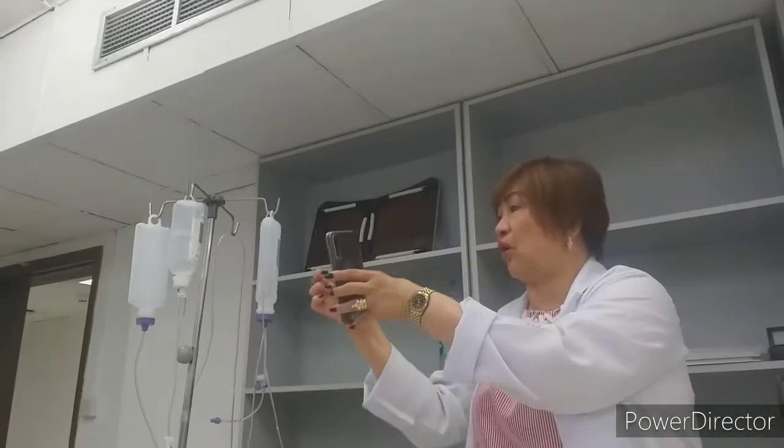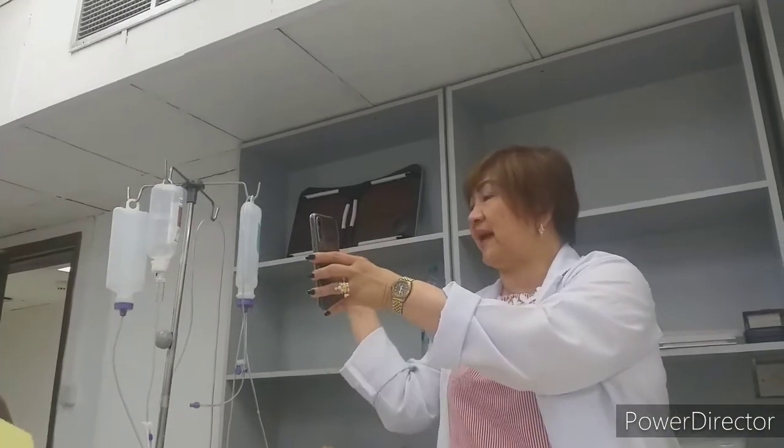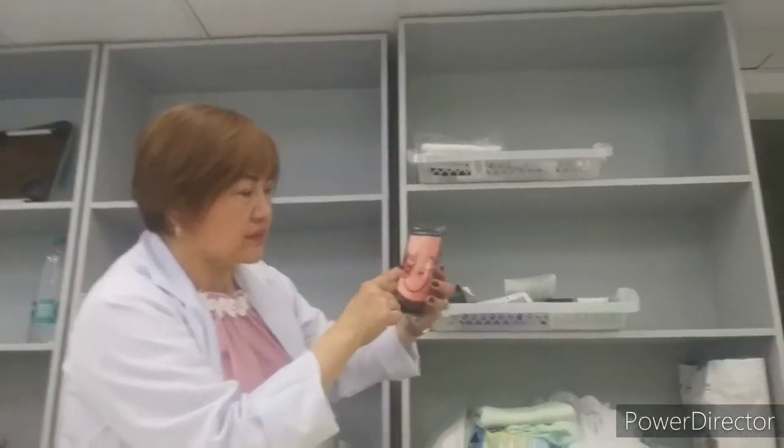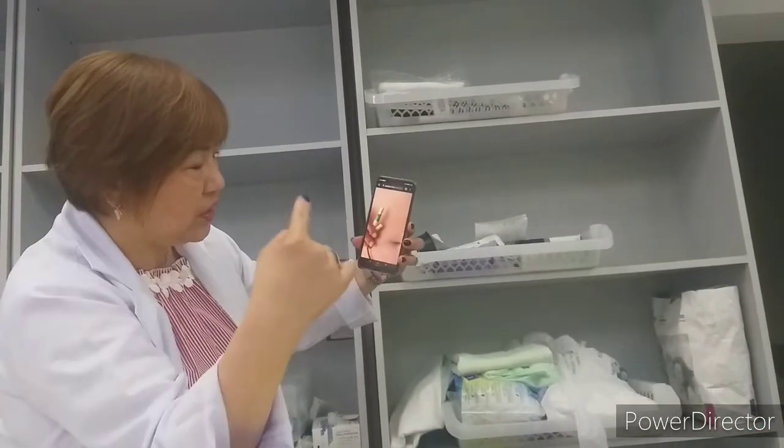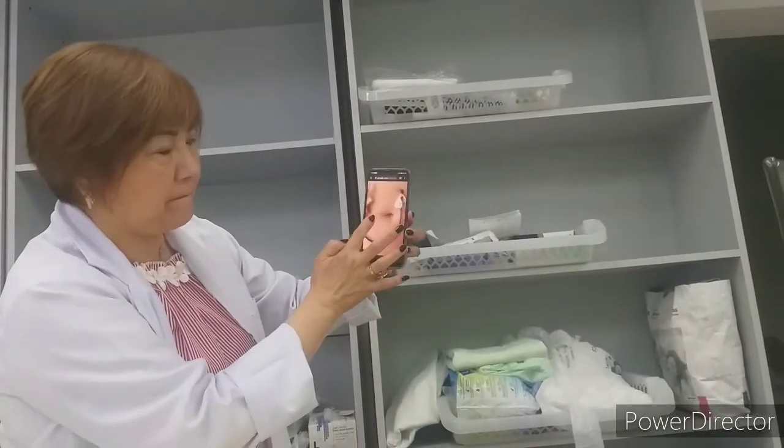So there are two openings. One for the medicine and one for your feeding. Ma'am, alin dyan yung medicine, yung sa baba, sa taas? Ito yon. Ayan o. Siguro dito, sa maliit. Maliit po yung medicine, yung pagkain, ito mahaba po. Siguro, doon sa tube natin. Okay?